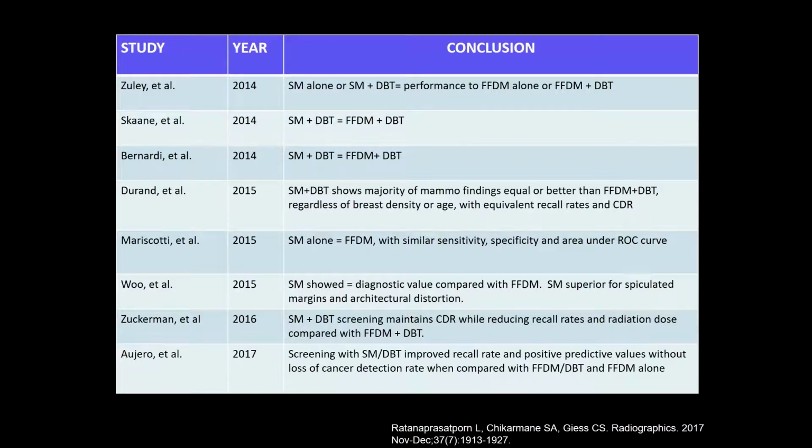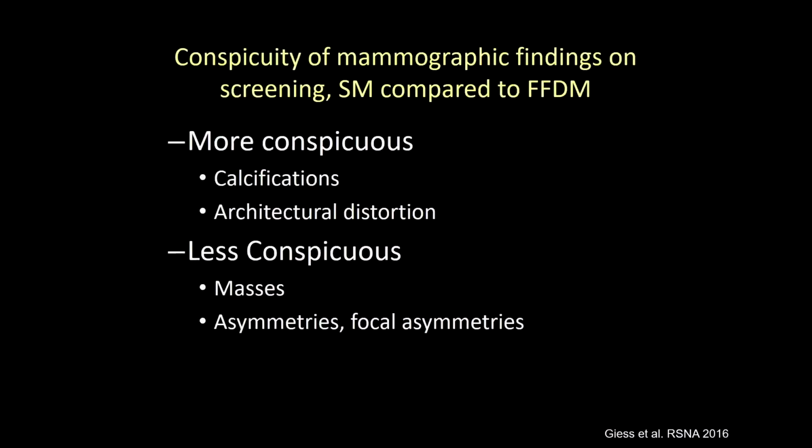And just as a note, just to remind everybody, the synthetic is really not to be used alone. It is only approved for use with tomosynthesis. So we do a lot of outside consult work, and if they bring in a disc and they only have the synthetic imaging, that's not adequate to render a mammographic opinion. You need the tomo data too.